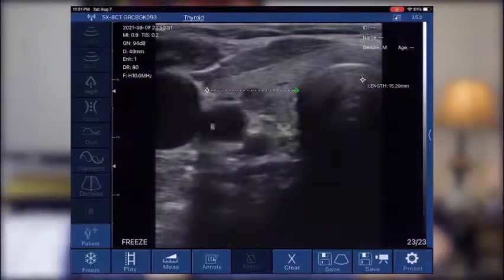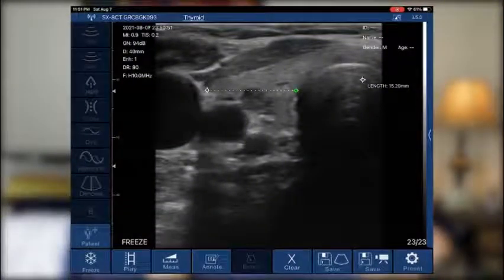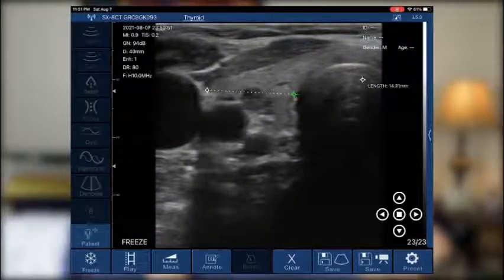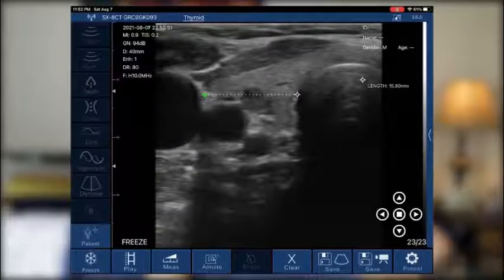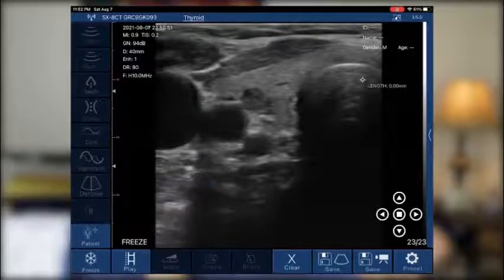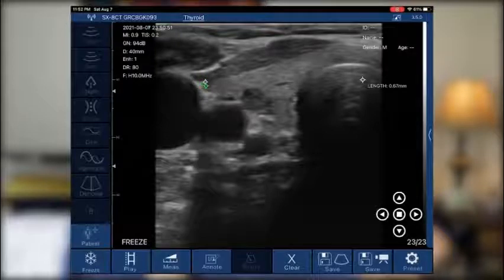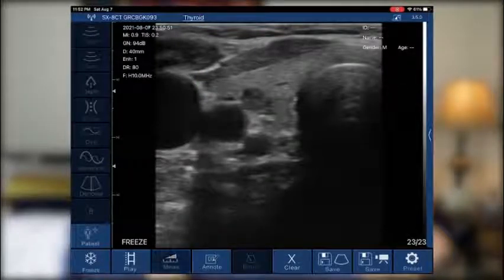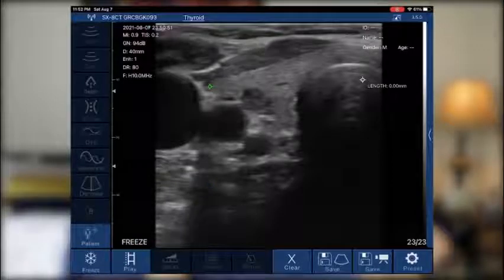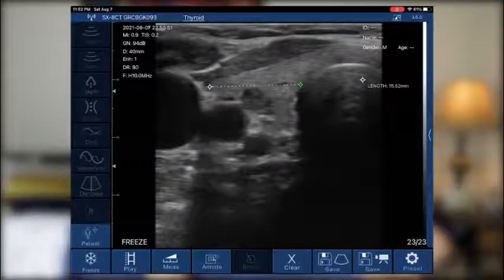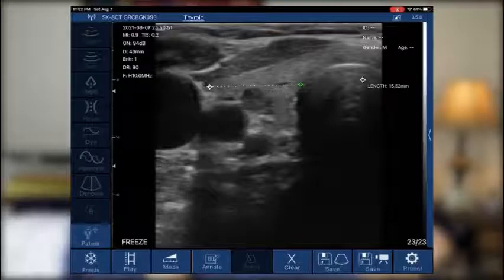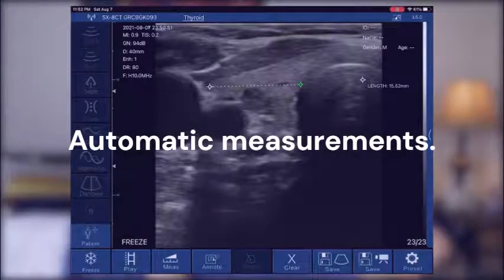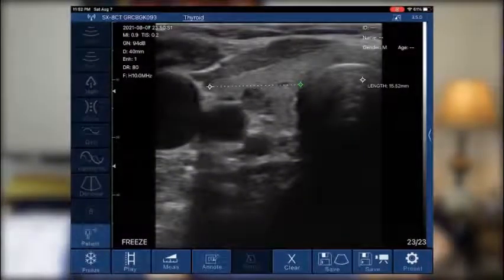The cursors light up in green, and whichever cursor pointer is lit up in green is the one that's going to move. So right now the medial aspect is in green and it'll move more laterally. Once I tap, it automatically measures — from one end to the other. I don't have to move the cursor around after that. It automatically gives me the measurement on the side, and it is in millimeters — 15 millimeters or 1.5 centimeters.